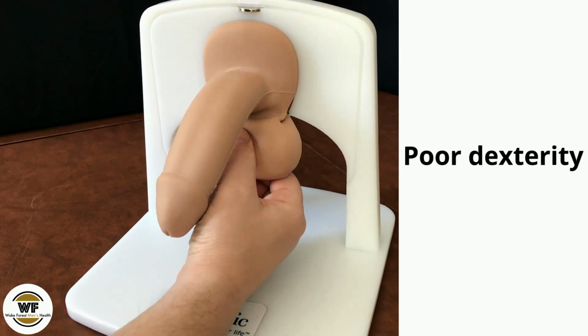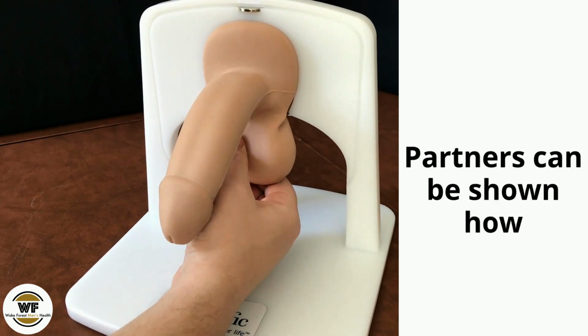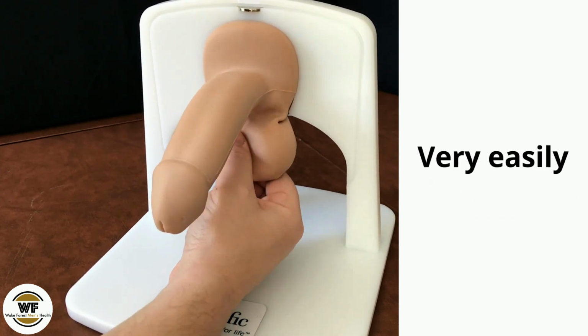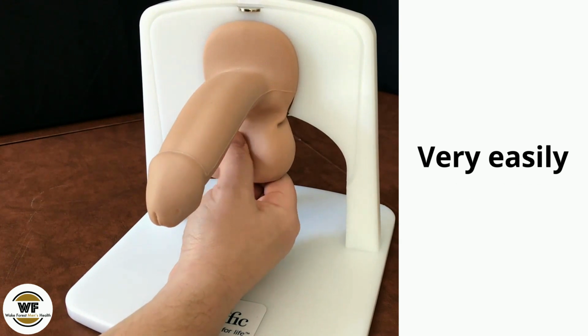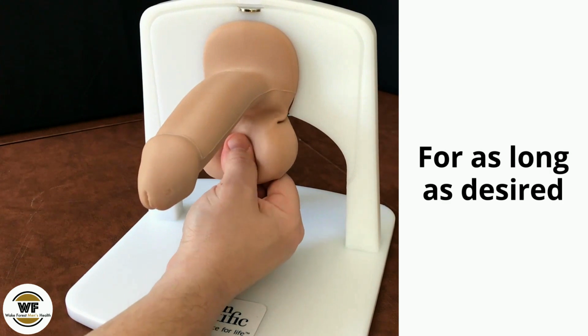For men with poor dexterity or decreased sensation in their hands, partners can be shown how to do this very easily. Once the penis is fully rigid, you can enjoy sexual activity for as long as desired.